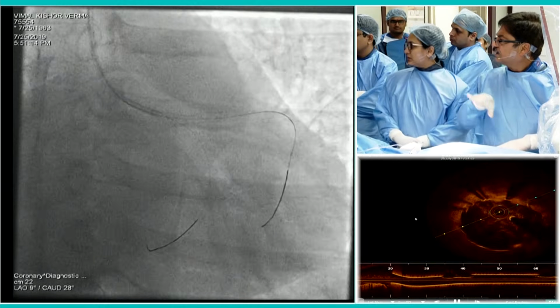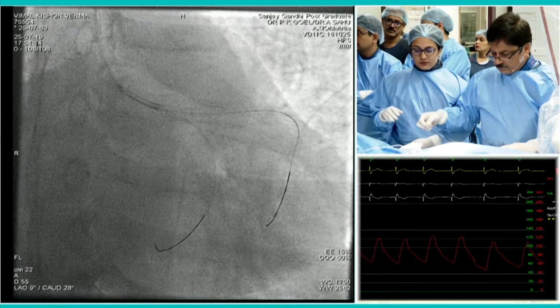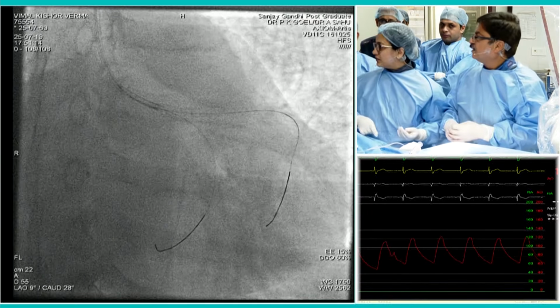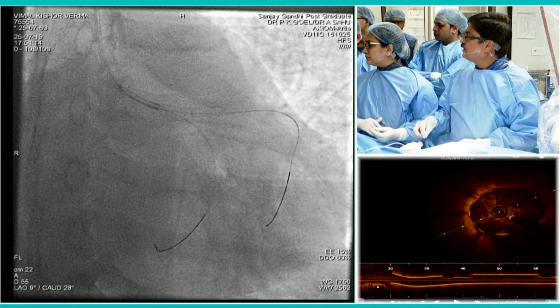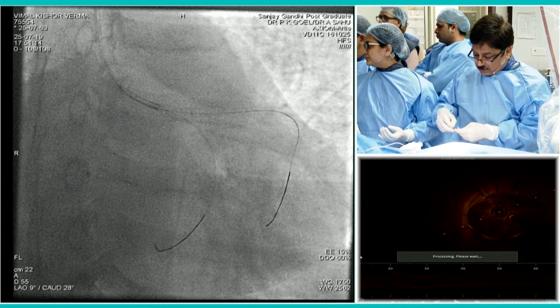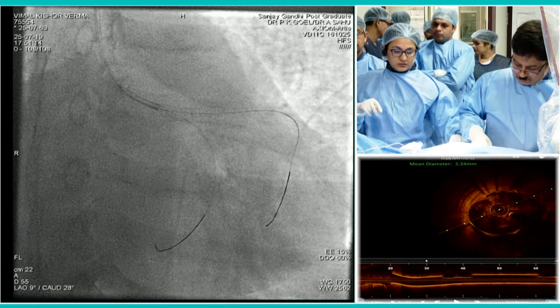I have to say there is no competition between IVUS and OCT; it's just a matter of technicalities, because if you are not used to either one, of course you rely on what you know. Yeah, we have a live webcast coming with Gary Mintz talking about the advantages of each technology. But for youngsters to learn, for novices to even imagine what it is, OCT is very easy to learn, with very catchy pictures, and with the three-dimensional reconstruction it looks more user-friendly. The only disadvantage is the contrast. If you can get away with it, I think it's better.